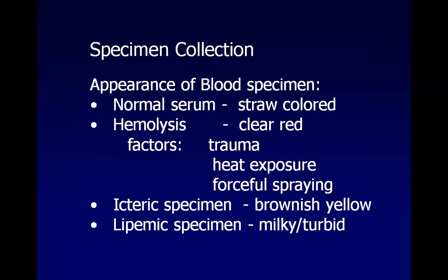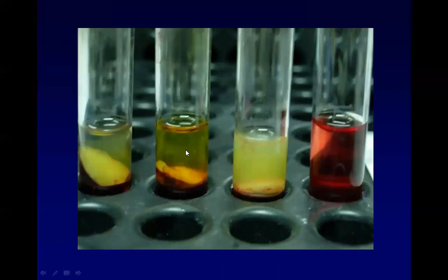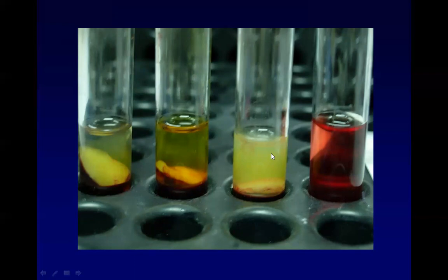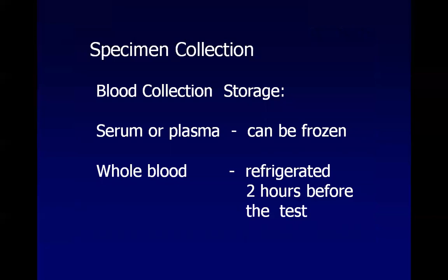Visually, the normal serum shows a straw color. The icteric specimen has a brown-yellow meniscus indicating bilirubin above 430 µmol/L. The lipemic specimen appears turbid and can decrease levels of amylase, urea, and cholesterol, identified by triglycerides above 400 mg/dL. Hemolysis falsely increases levels of blood constituents.